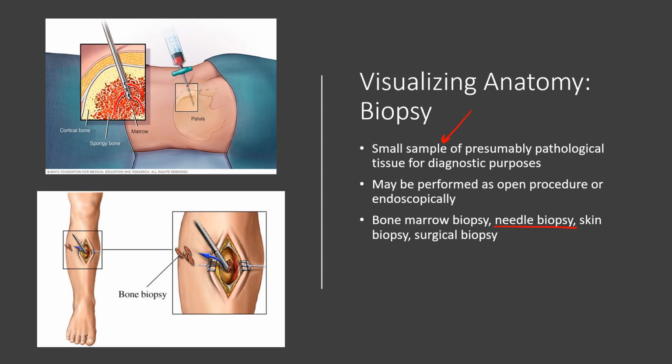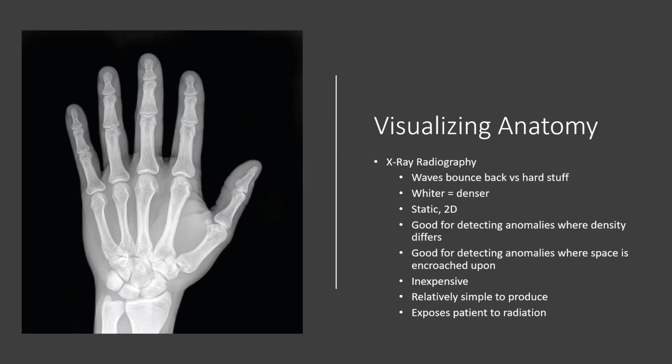I guess it looks more like a cross between a 3-hole puncher and those claw machines at an amusement park or something, where you have to find the little teddy bear and get it into the slot, but it never works. It looks like a combination of those things. It goes in, takes a chunk, and pulls it out. The only unifying theme with all of these, though, is that you're going in to take a sample and sending it off for examination for pathology.